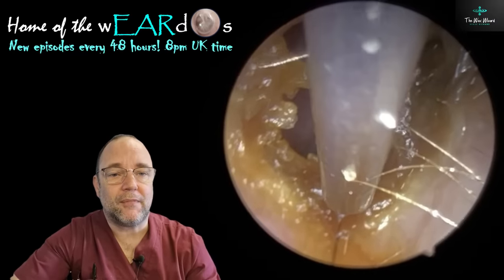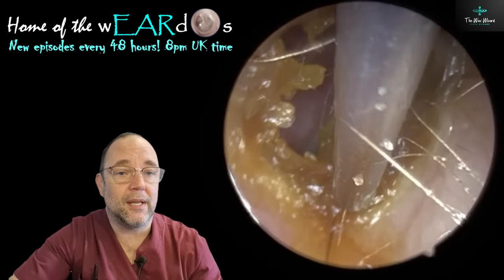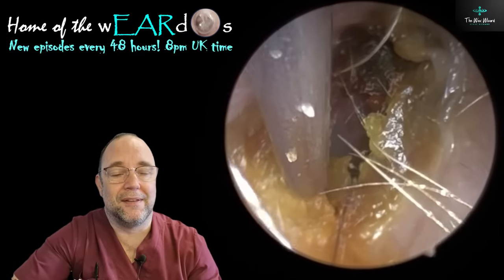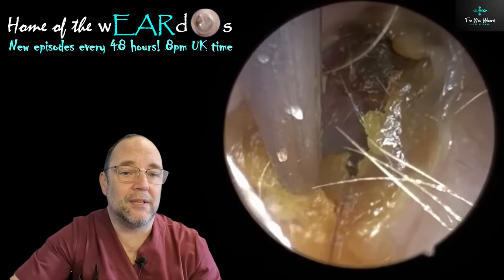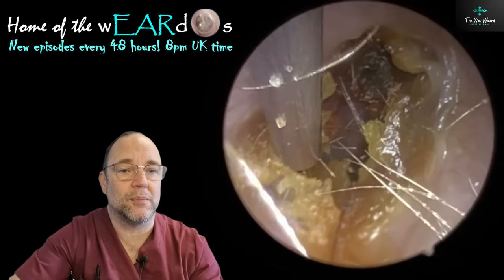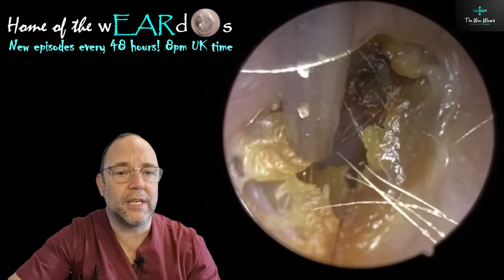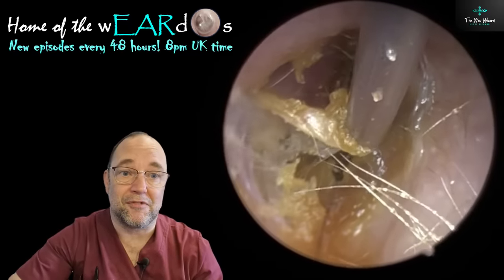I think this was done in public health as well. They don't have the same type of equipment that we do, and they certainly don't get allocated the same amount of time. I'd like to say there's some benefit of the doubt here, but there's just too much left here. He's a hearing aid user as well, so it's going to vastly affect the ability of the ear and aid to work properly when you've still got these around the edges. There is a path through to the eardrum, so I suspect they just cleared out the centre of the blockage and thought he could probably hear again - which he could. But he said he could feel he wasn't still quite right, and he wasn't wrong. Far from wrong, in fact.